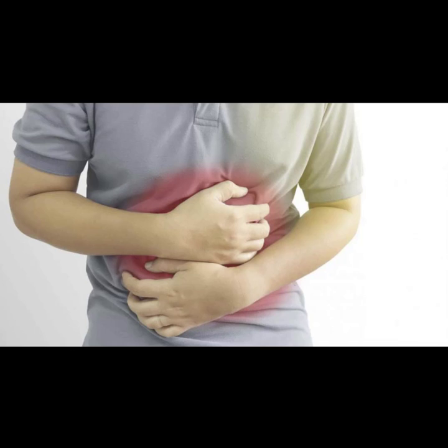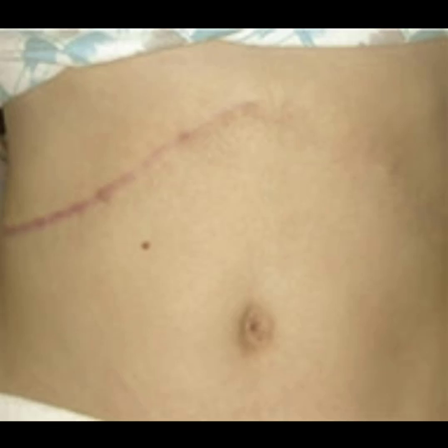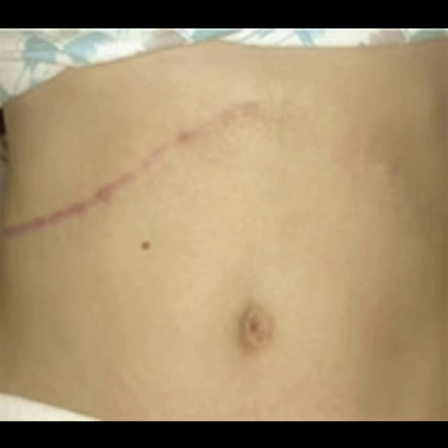Ask how long their symptoms have been present and if anything helps to ease symptoms. You won't always have access to the EMR, so ask questions about any previous lab results, imaging, or surgeries. Look at the patient's abdomen for any obvious scars. Cholecystectomies are common, with about 300,000 happening each year. Not visualizing the gallbladder due to removal is very different than due to hepatization or perforation of the gallbladder.